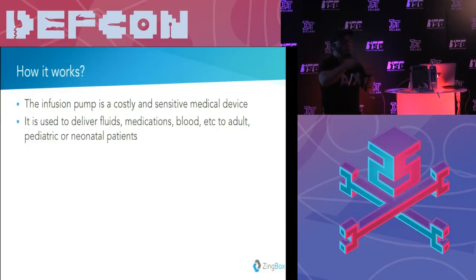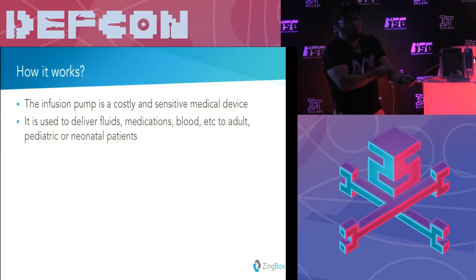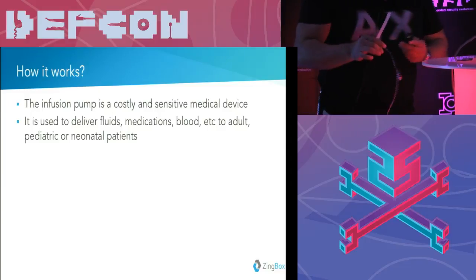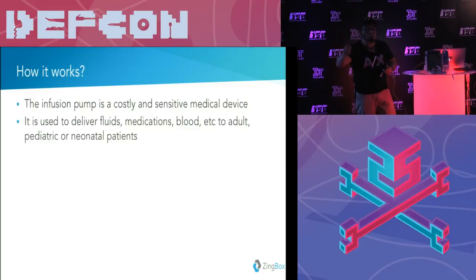You will see a bag, and on the other side, it is connected to the human arm, and it starts delivering the fluids. It's automated, and that's the main thing: you can program it and say, okay, 50 milliliters for the next 2 hours, you leave it there, and it's going to start feeding the liquids.